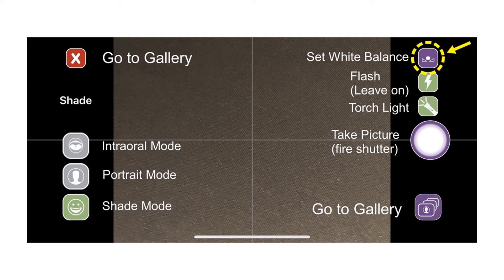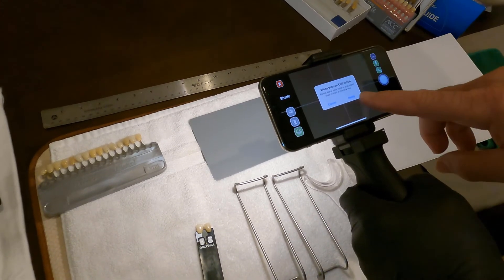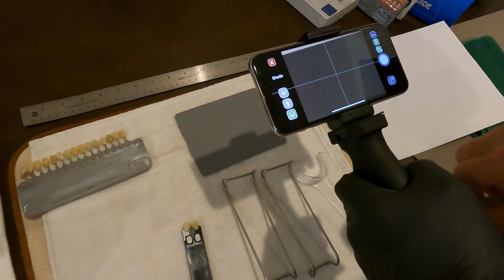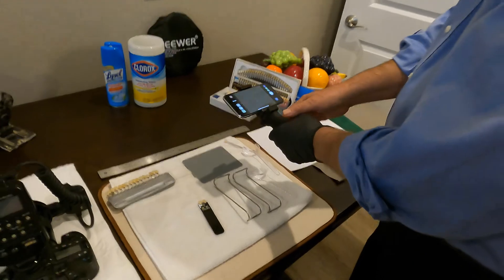I'm going to push a little button here in the upper right — this is also done on the setup. It says white balance calibration, and it says ready, so I'm going to click on ready and then save. The gray card now looks great, ready to take photos.